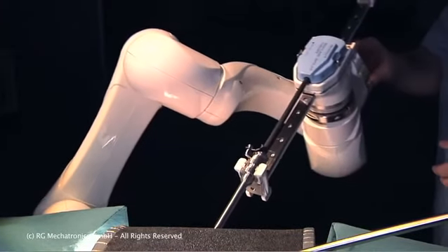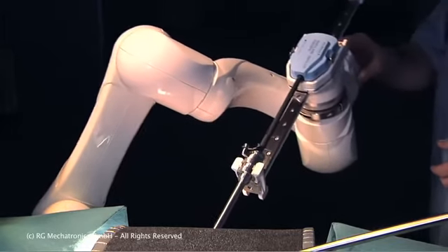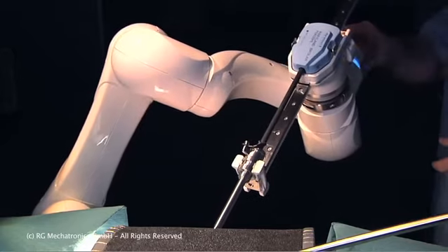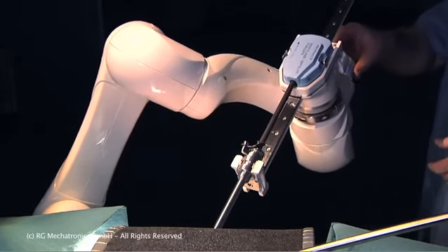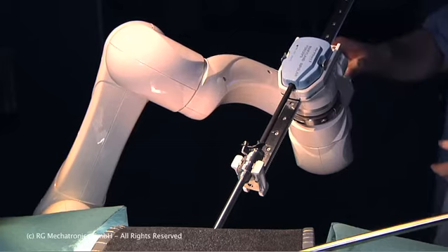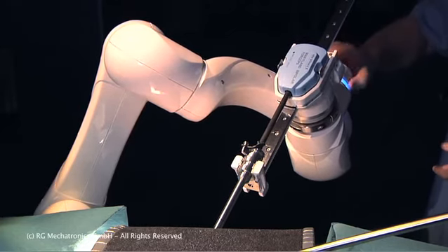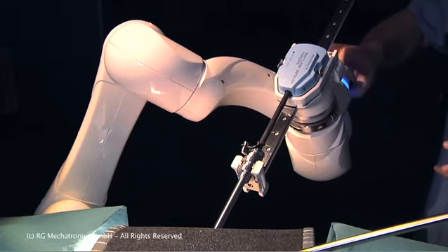In the main picture, the orientation remains constant, while in the side view, the rotation is changed. Here we see another view of the same operation, first with a fixed rotation, and now the tool can be moved in and out, and the trocar holder holds the trocar still. Fine adjustment is again performed by the ring.